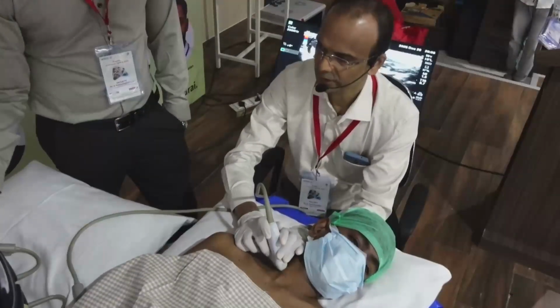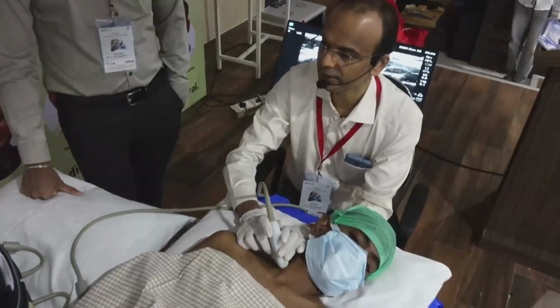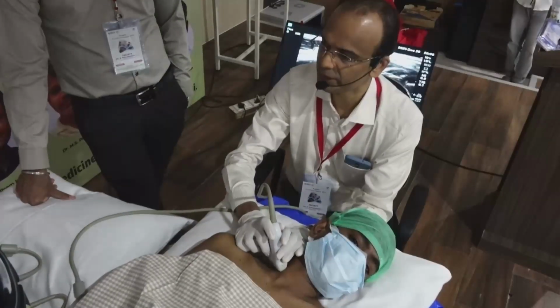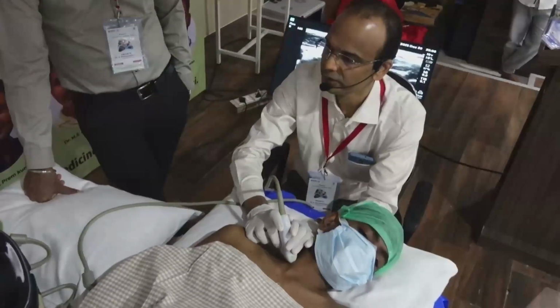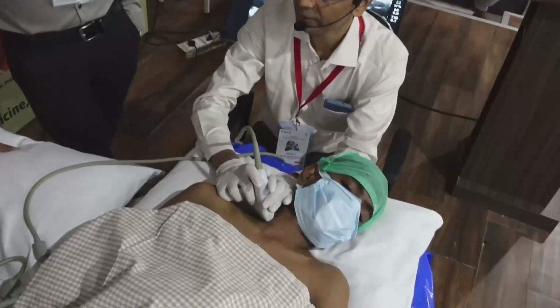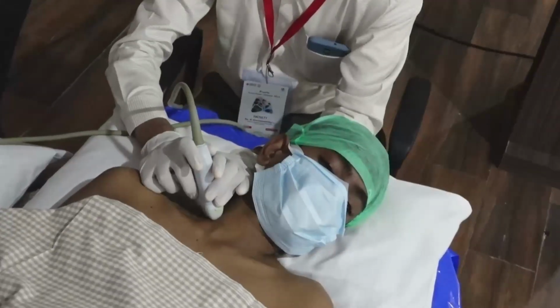Previously, before the ultrasound era, there were a lot of bad reports, especially bad neurological injuries, because of injury to this vertebral artery. So always we have to take care of that. Look for these vessels so that we can avoid major neurological damage, even to the brain.